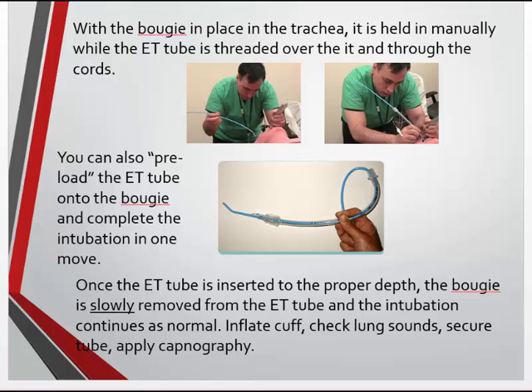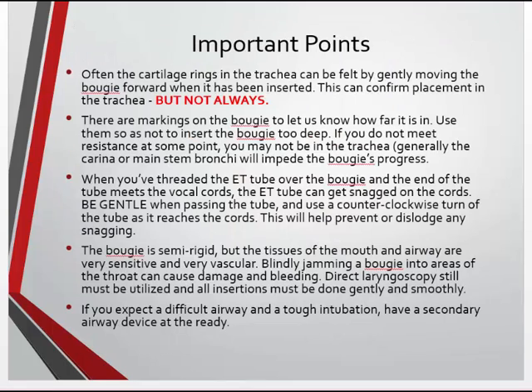You're going to fill your cuff, check your lung sounds, apply capnography, and do everything else. So hopefully this has helped you get in. All right, some important points to remember while you're doing this procedure, and you're going to have an opportunity to do this hands-on with one of us.